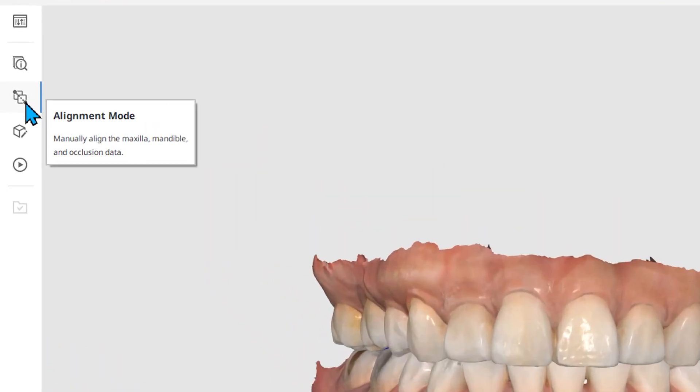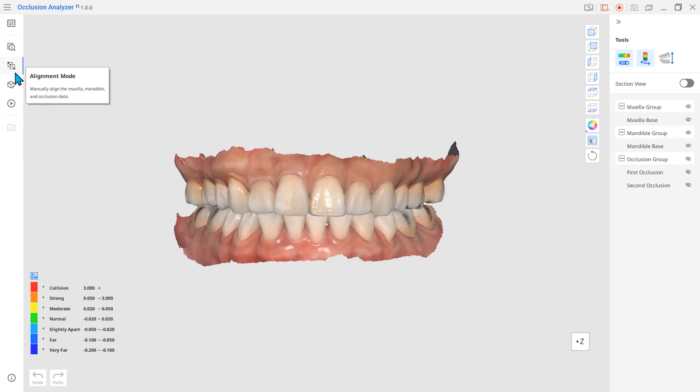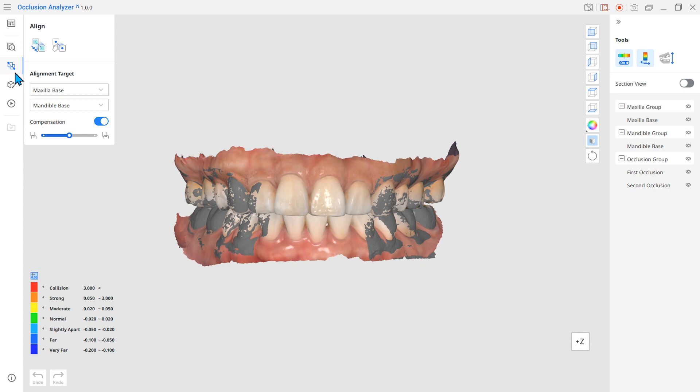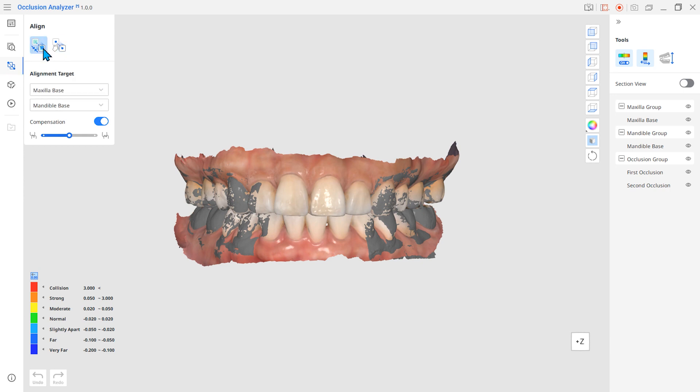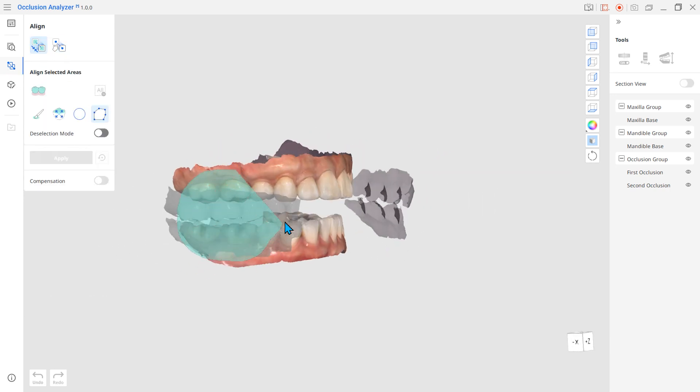Another great feature is that you can realign your data right in the app's alignment mode. Provided tools allow you to realign based on the selected area or points.